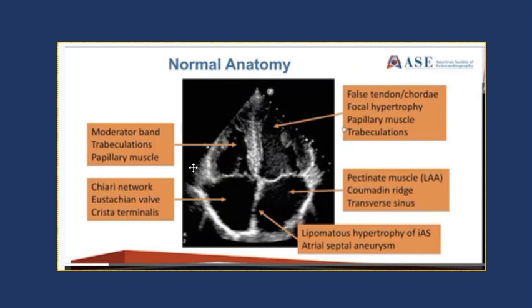Similarly, in the left ventricle you can have a false tendon, focal hypertrophy, or papillary muscle hypertrophy. You can also have trabeculations, all of which can again be confusable with thrombus if you're not sure.